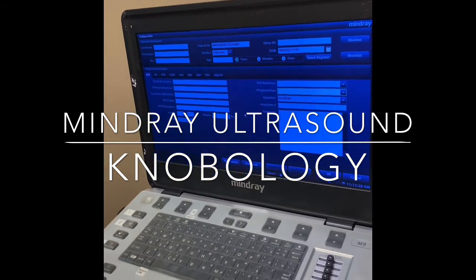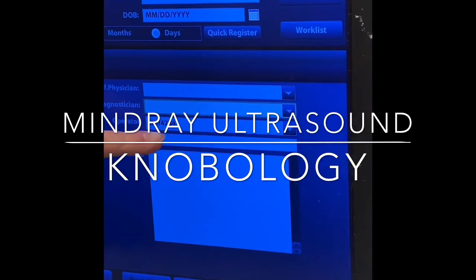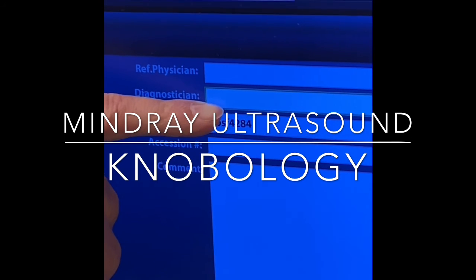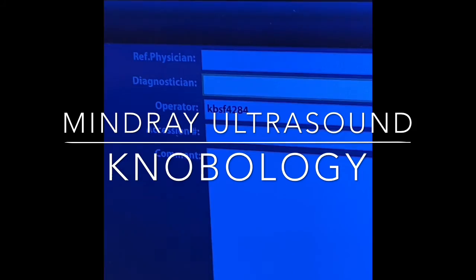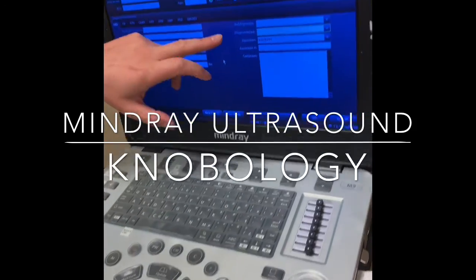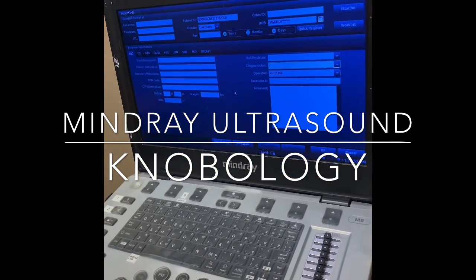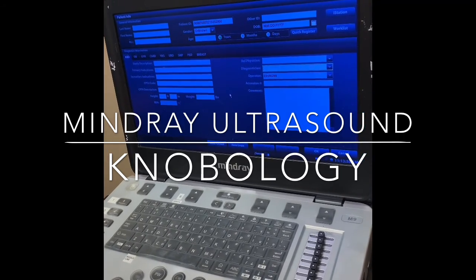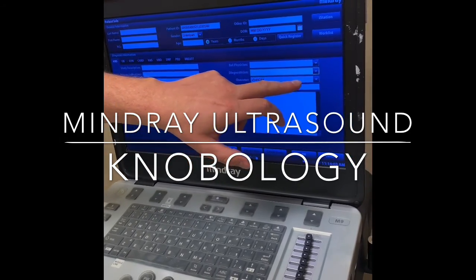Please note that for residents, PAs, and med students, they will go into the operator field. Attendings will go into the diagnostician field. This will just change the field where your name appears in QPath from operator to attending. Only one attending at any given time could be in this diagnostician field. If you're scanning multiple operators who are not attendings, you can scan each QR code one after another, and they will populate in this operator field.